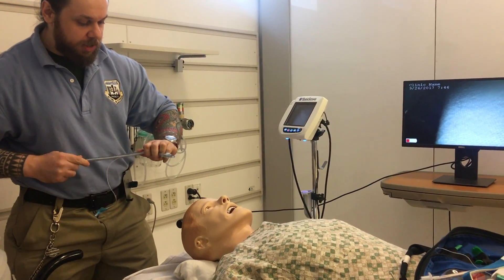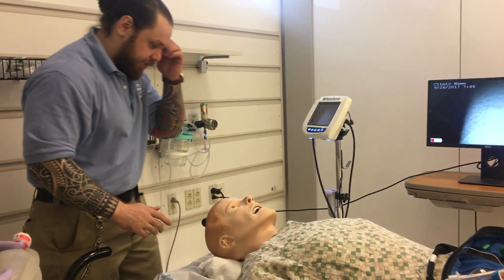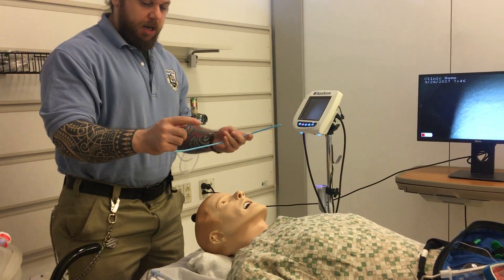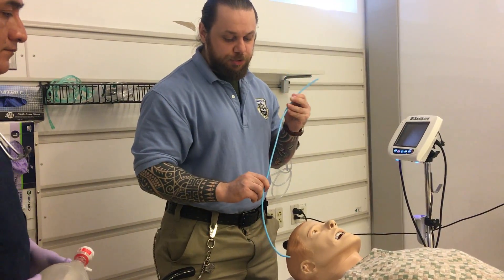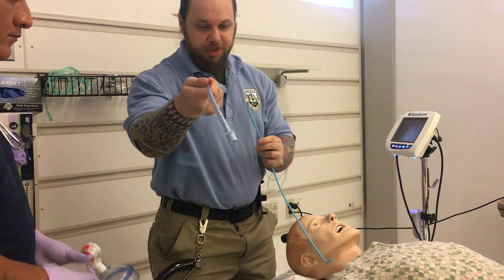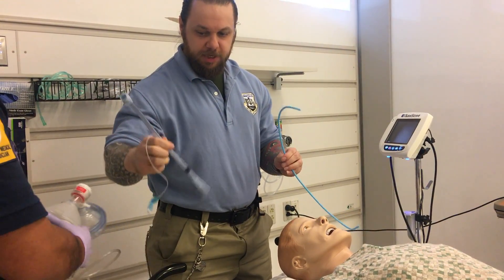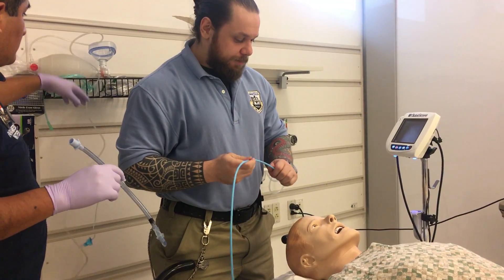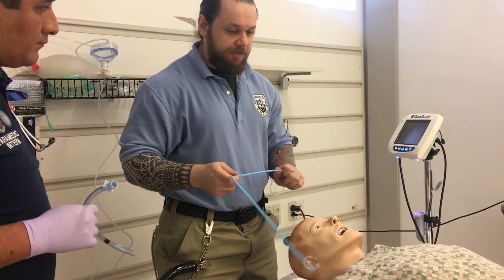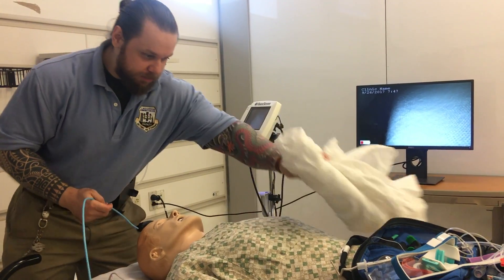If you have a patient with a very anterior airway and it's hard for you to see, you can utilize a bougie — also called a tracheal tube introducer. Once you're in the correct location, have your partner lace the endotracheal tube over the bougie. This device allows you to place a tube when you don't have a really good visualization.